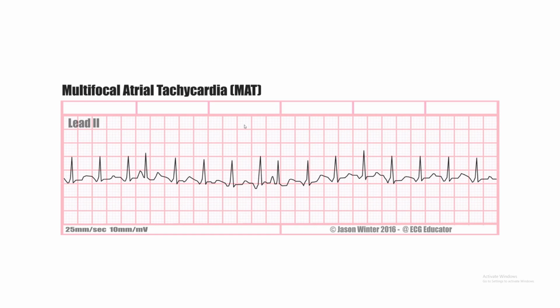It might be indistinguishable from a normal sinus P wave, but you have a heart rate of 160. That's how focal atrial tachycardia can present, and you might not even know it's focal atrial tachycardia until the patient tells you that they had it before, or you are working in a hospital and you have multiple different EKG strips to reference while you're looking at a patient's case.